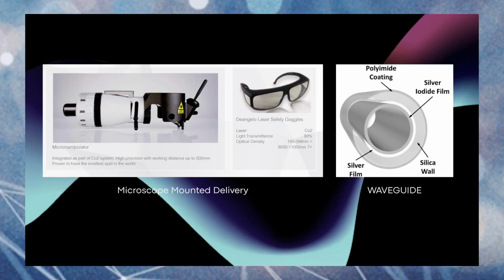One advantage also of the CO2, because it is highly absorbed in the silica, is that you can wear just any regular glasses typically. So you can have clear glasses when working. When you're using other frequencies that are within the visible spectrum, which includes KTP and the newer diode lasers, you have to have colored glasses to block that frequency of light. So you have some problem with the visualization. So it obstructs your view somewhat because of the shading effect.